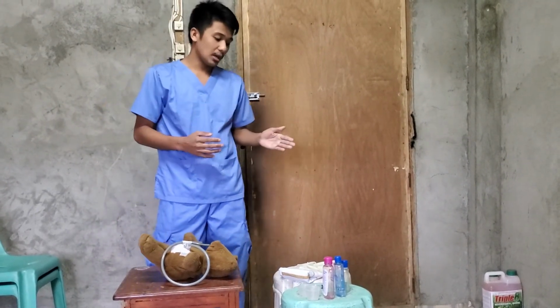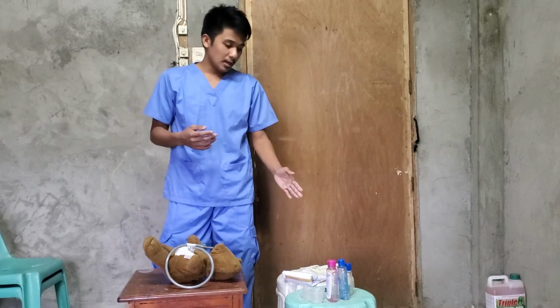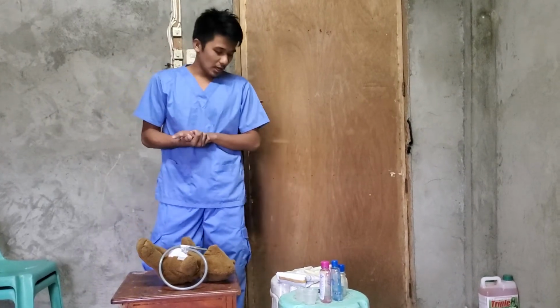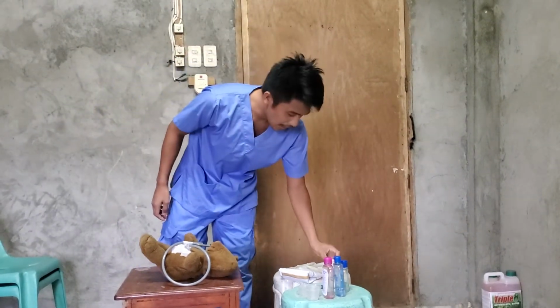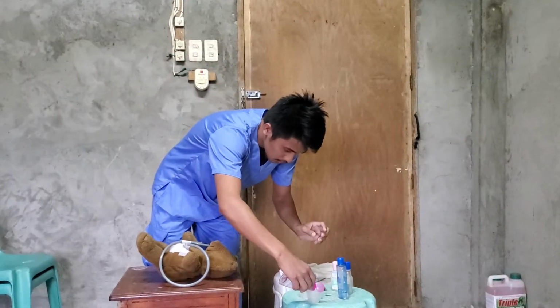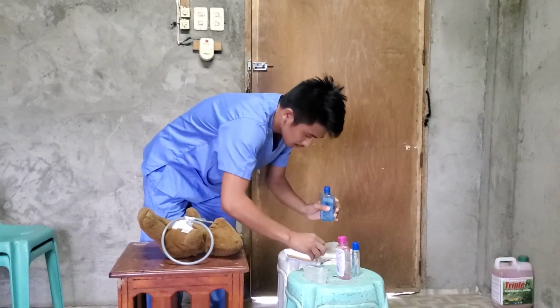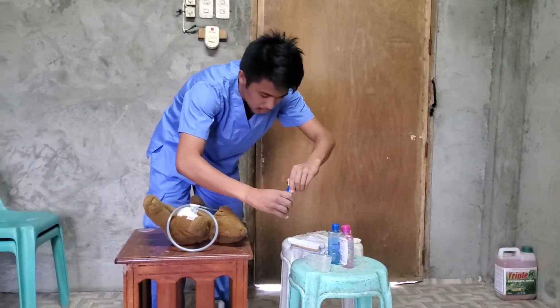So first you need to check the administration form or record, also the medical provider form, and also you review the administration medication form and the patient or guardian consent form. And also you need to check the medication if it's expired or not. Then after that, preparation for liquid medication, and also the water that is used in the procedure.